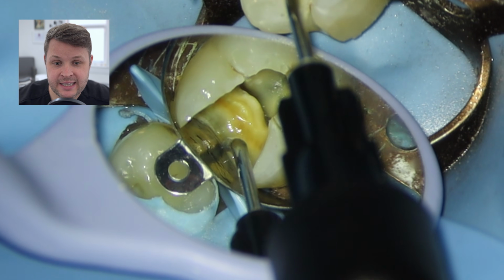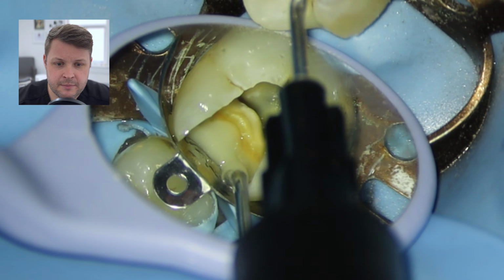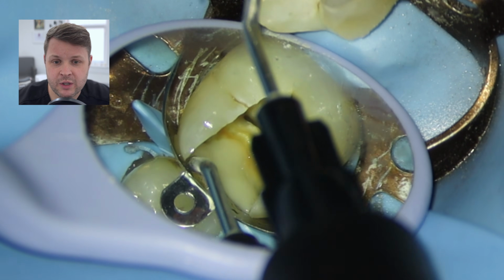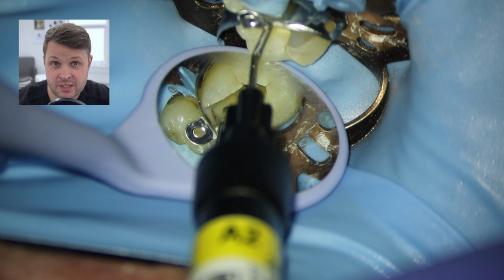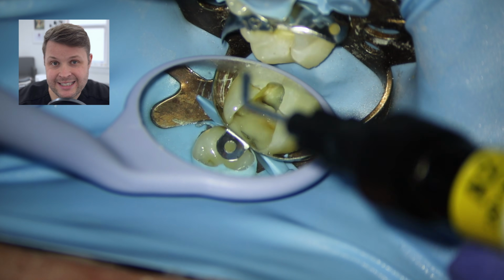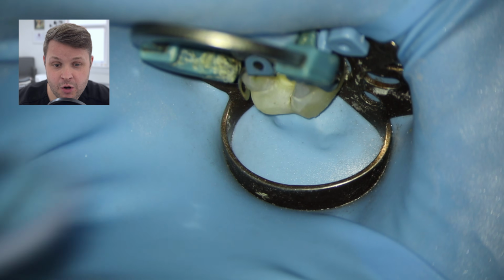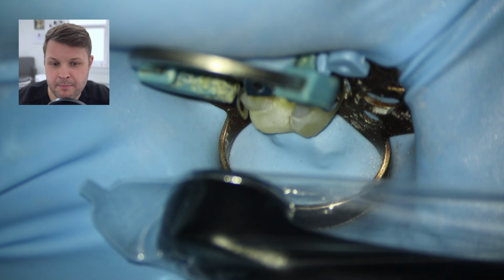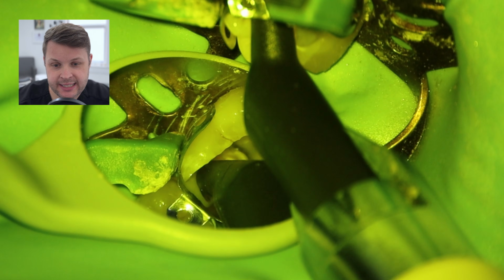And now I'm going to place a little bit of flowable in the base of this cavity, and the flowable just goes into all the little nooks and crannies of the margin. You don't want to place too much, of course, because its structural integrity isn't great, and I can see here that it's not really well adapted to the tooth, so I'm going to place a Palodent ring over this, and the adaptation's a little bit better. Although, like I said, with the Garrison, I feel like that adaptation's probably a little bit better.